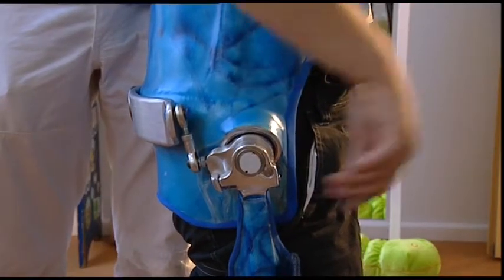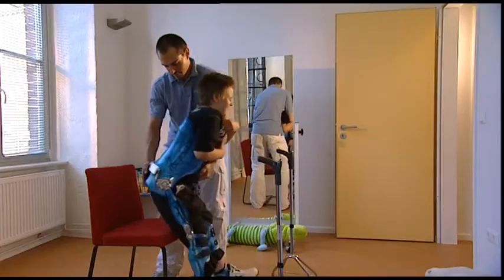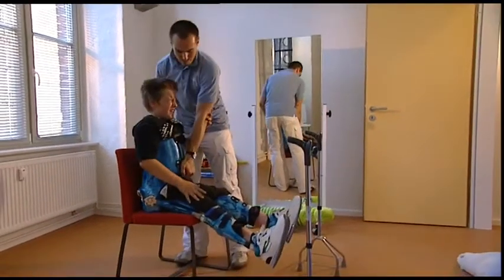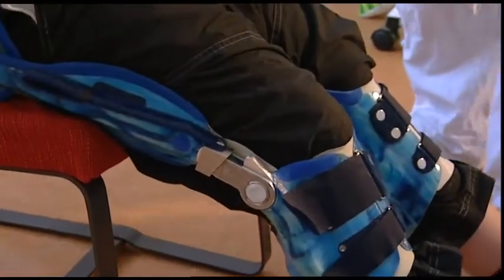Taking a pause is as important as the training. While sitting down, the horizontal axis gets released again, and subsequently the knee joints are unlocked.